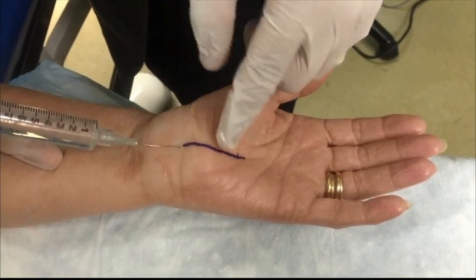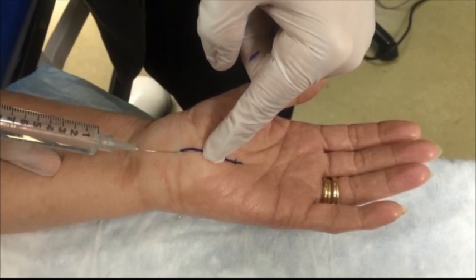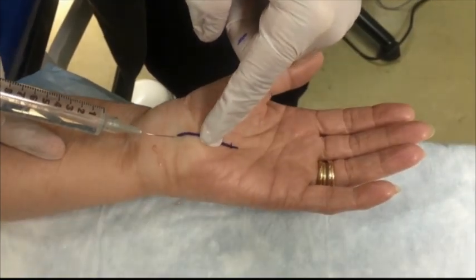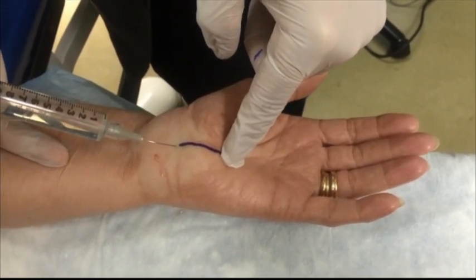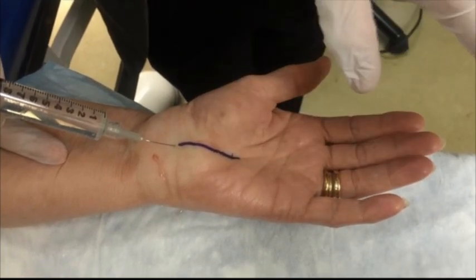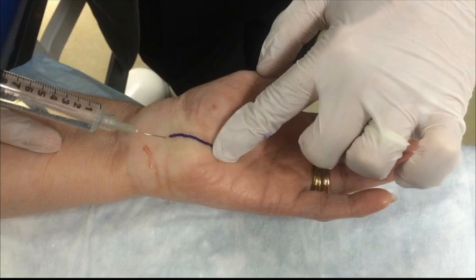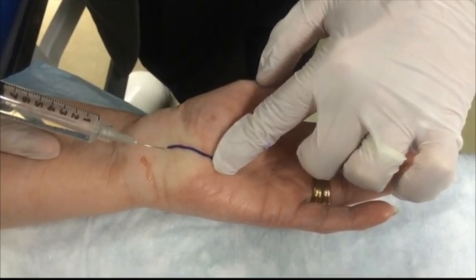So I put my needle proximal to the wrist crease, at least a centimeter back from where it's white. If it's white, I have functioning epinephrine molecules; if I have functioning epinephrine molecules, I probably have functioning lidocaine molecules. Muriel, did you feel that needle go in? No. That's what you want — just the first poke and nothing else. I always want at least a centimeter of local ahead of my needle tip, and I'm always thinking: blow slow before you go.